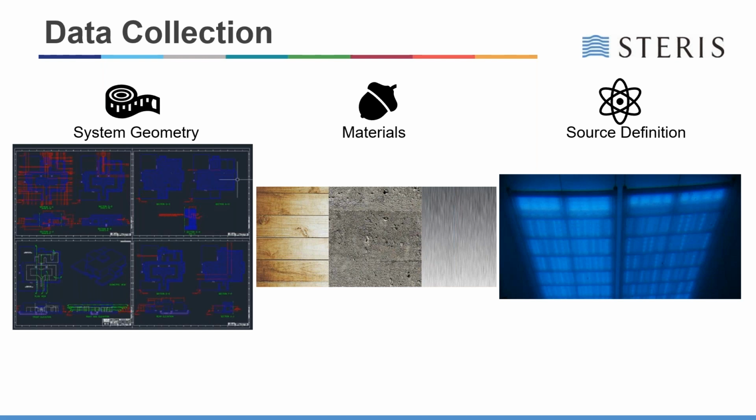So this could be a scanning extent for an accelerator, or as shown here, an activity distribution for the gamma irradiator. As shown in this image, the activity distribution is absolutely necessary to correctly predict the dose distribution within product. Without knowledge of the distribution, you wouldn't have an idea about that tight formation of sources up here on the top left.